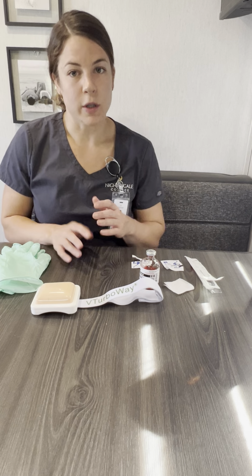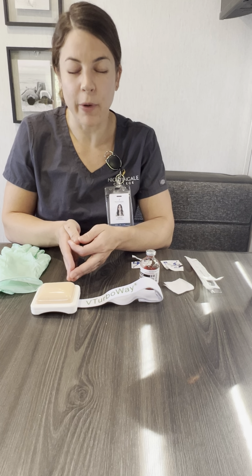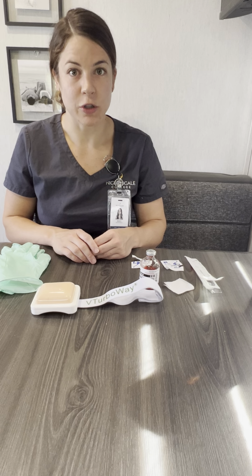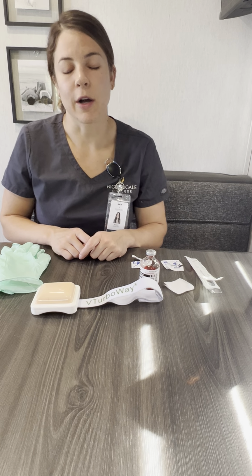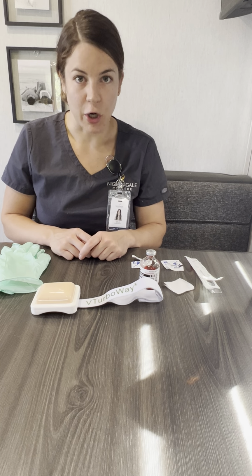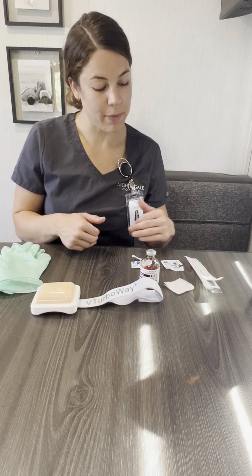So the orders today are 5 TB units per 0.1 milliliters of tuberculin injected intradermal. I will verify that with the medication. And the 6 rights of medication are making sure it's the right patient, right dose, right time, right route, right medication, and right documentation. After I've done that, I will gather all my supplies and I will head to the room.